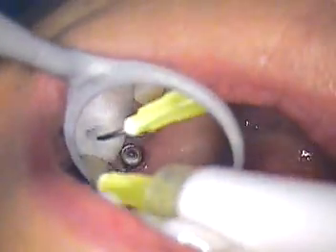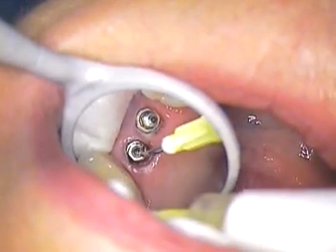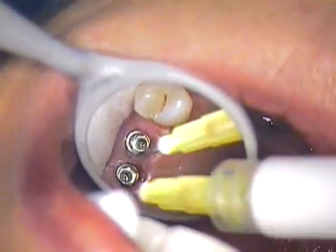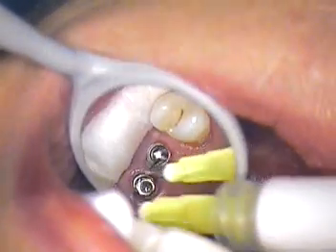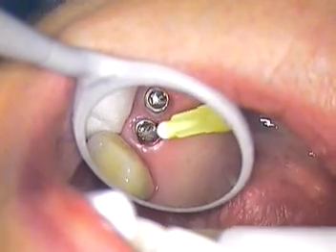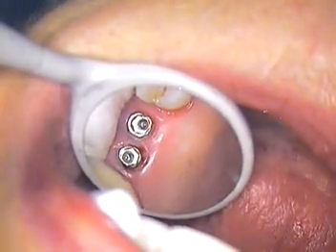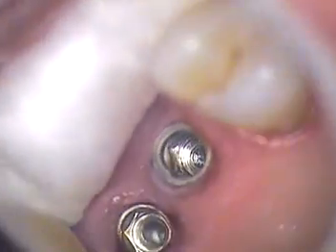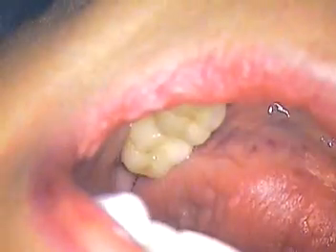Coming up on a break. I'm just going to do a quick vacuum and give you a little downtime here so I can finish up. You doing okay? So you've got a brand new, almost brand new situation now with the threads. Nice and clean. Those are very nice. Great — so you can close on cotton just so nothing goes in there.